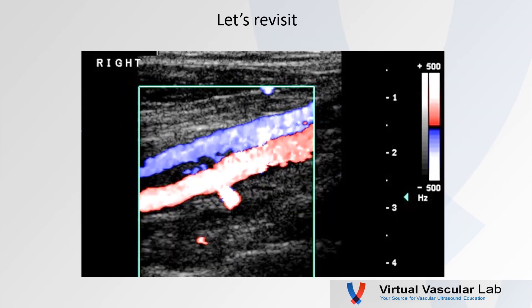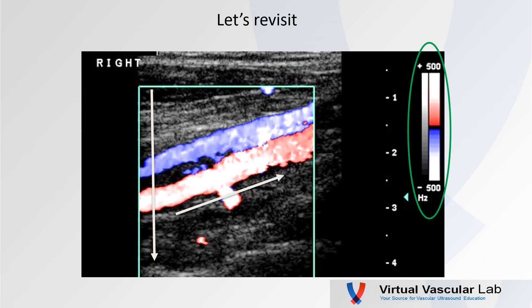Now let's revisit these popliteal arteries. First, check our color bar: flow towards the transducer is red, flow away is blue. Our look angle is straight down. The popliteal artery shows flow towards the transducer — moving from left to right. The vein shows flow away, moving right to left. But how about this collateral down here? Flow towards the transducer — this is an inflow collateral. It shouldn't be.